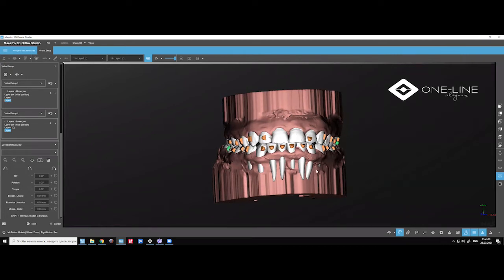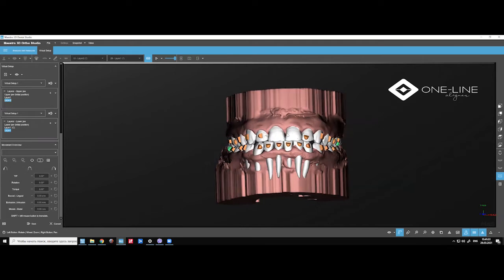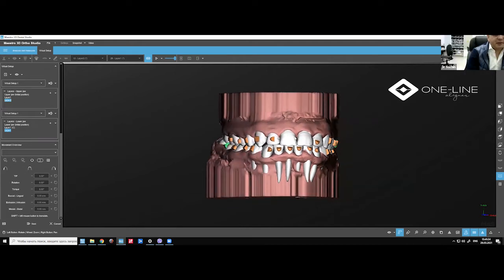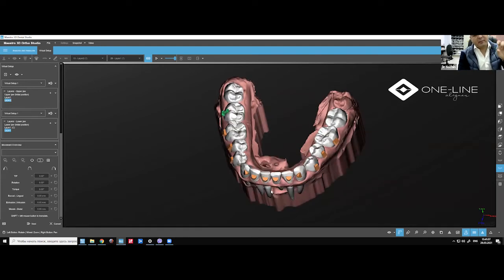Here's Sachin, here's just a question with the thickness of the aligners in the posterior, the same as in the front? The thickness of the aligners? Yes. In this particular case? For example, yes. Okay, for this case, if you have smaller teeth here and bigger teeth here, the thickness will be a little more. They'll be thinner in the backside, but thicker in the front because the size of the tooth is small. Normally, I have seen if you want to go for expansion and you want to go for intrusion, it's good or better with thicker aligners.